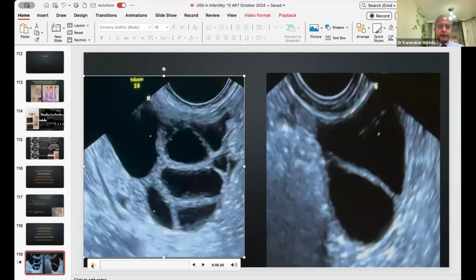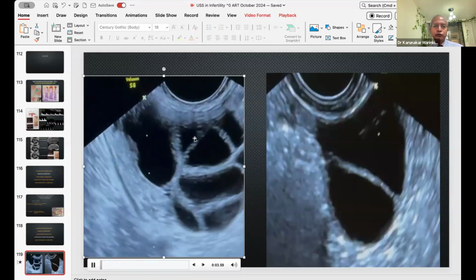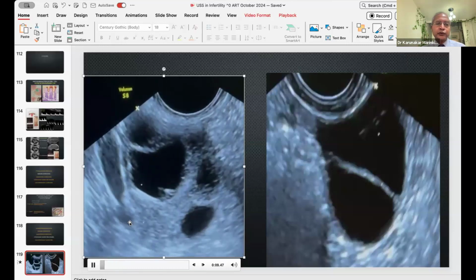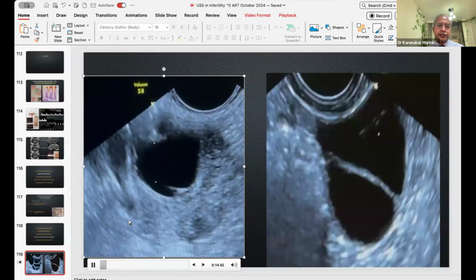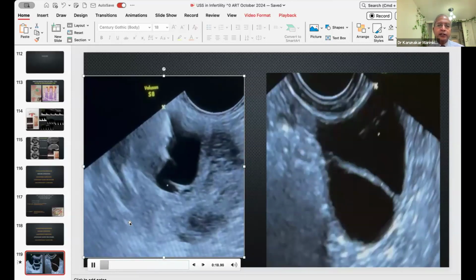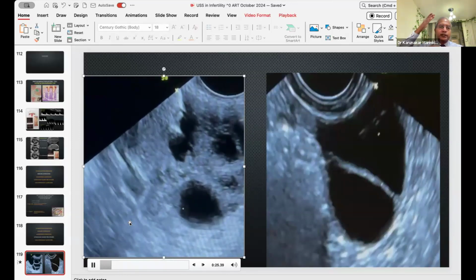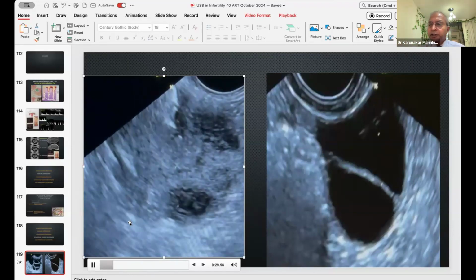So this is the left ovary. That's the right ovary. I fix the ovary so hard. Trust me, the iliac vein gets compressed. And that's what my Dr. Tom Matthews, who made me do collections in Bourn Hall, Cambridge, and Peter at Princeton, said: fix the ovary with your muscles, use the lumbricals to perforate the follicle. And you always keep the bevel of the needle at 12 o'clock so the ultrasound can see it. Every one of you doing a collection must see the bevel of the needle.